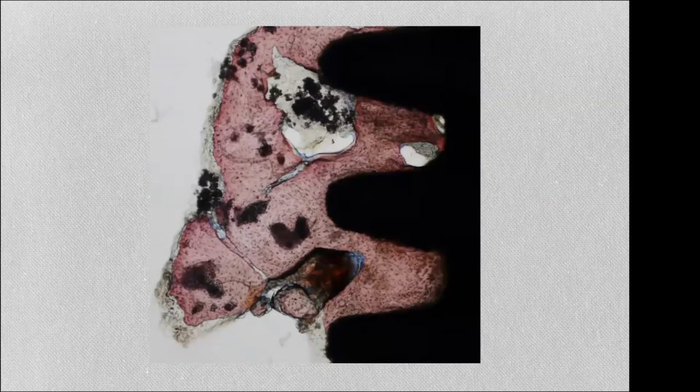This is going a little bit farther up. We're still in native bone. A little farther up, we see a little bit less magnification. Now we're encountering some of the graft particles that have been encased, and very few of them are left. And yet what's telling is that in the plateau spaces, which are bone growth chambers in our consideration, the bone has formed very well. The graft particles have resorbed or been incorporated, and this implant is integrated. Now remember that the implant and the graft were placed together at the same time.